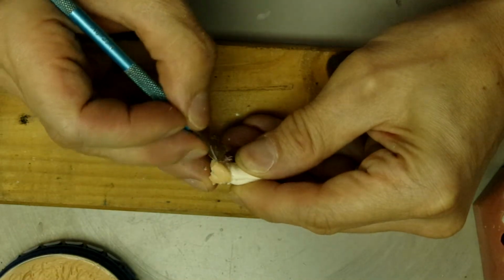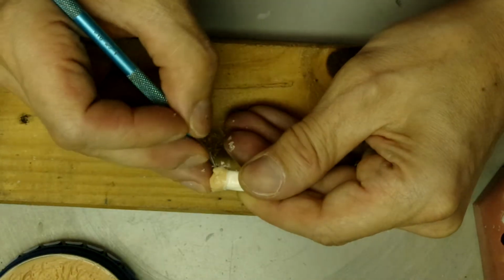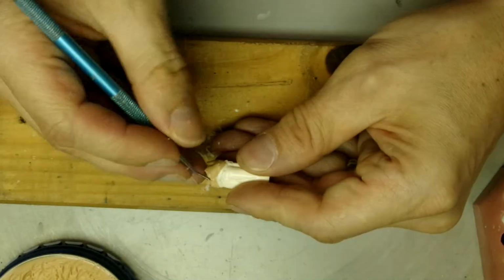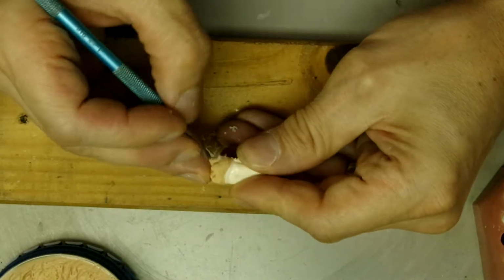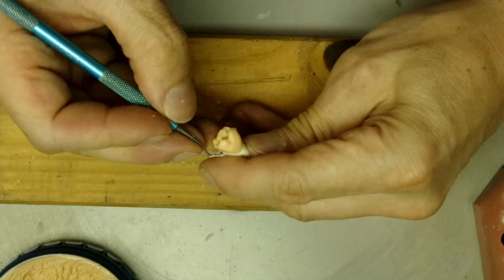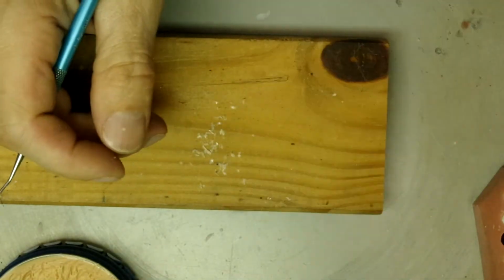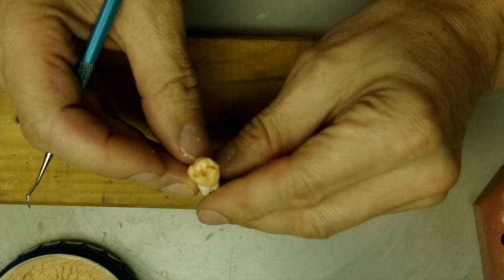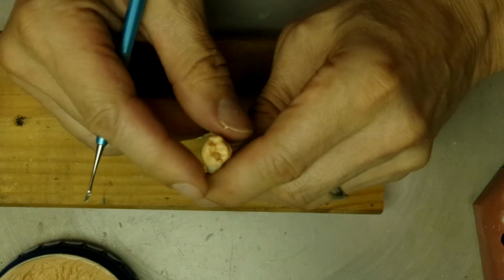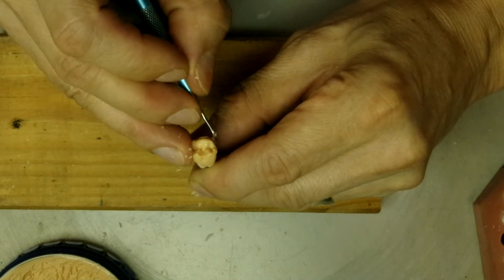And give it a nice emergence from the gum so that it doesn't keep popping out. And remember, rhombus. See the shape? Rhombus.